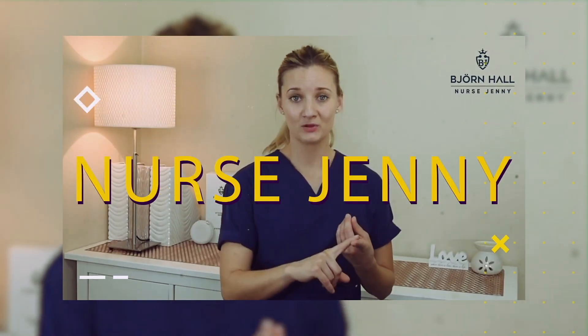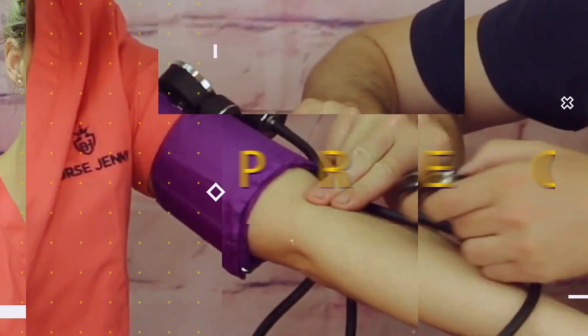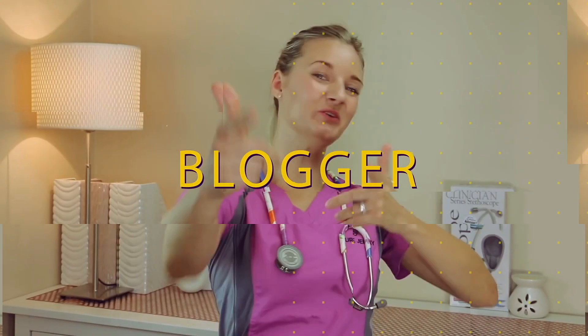ADC AdScope 603 versus ADC AdScope 608. Let's go. Can't decide whether you want to spend a little bit more money on the 608 or a little bit less on the 603? In this video, I will show you the differences between the two.